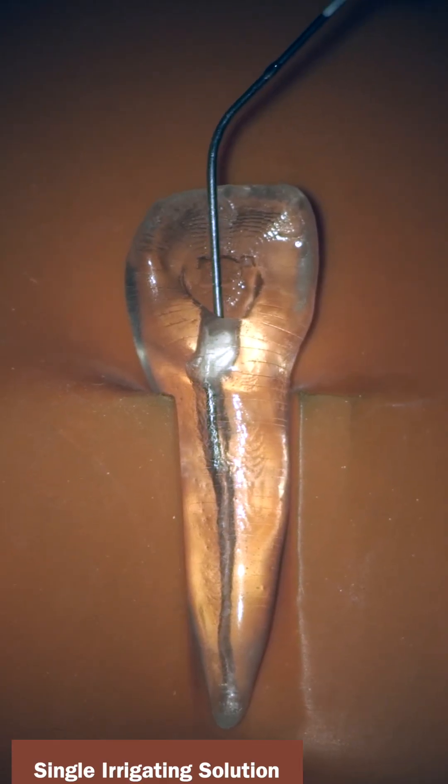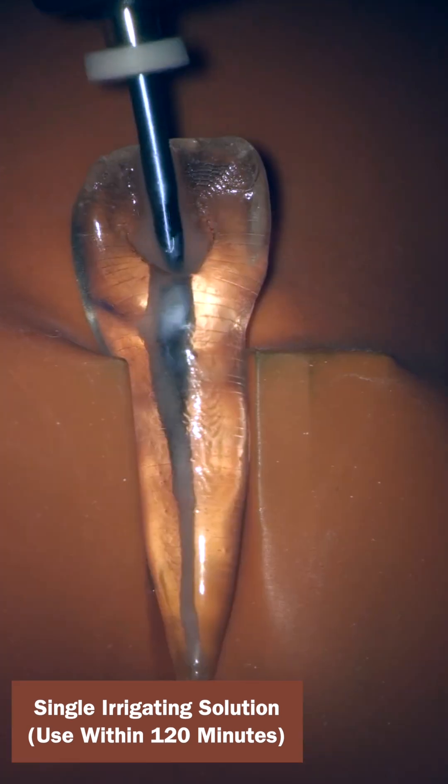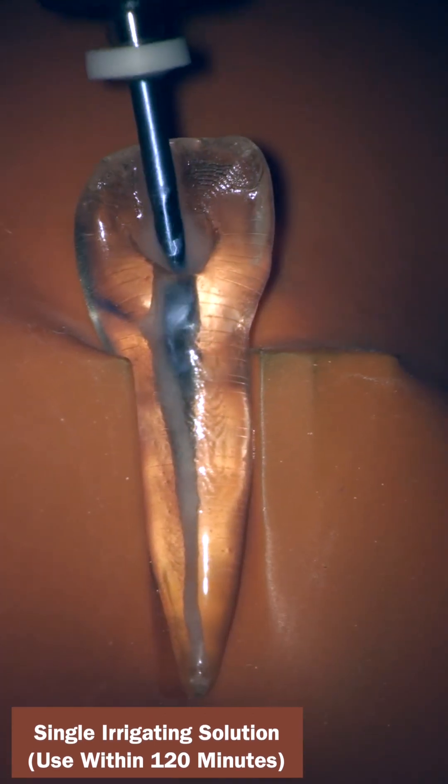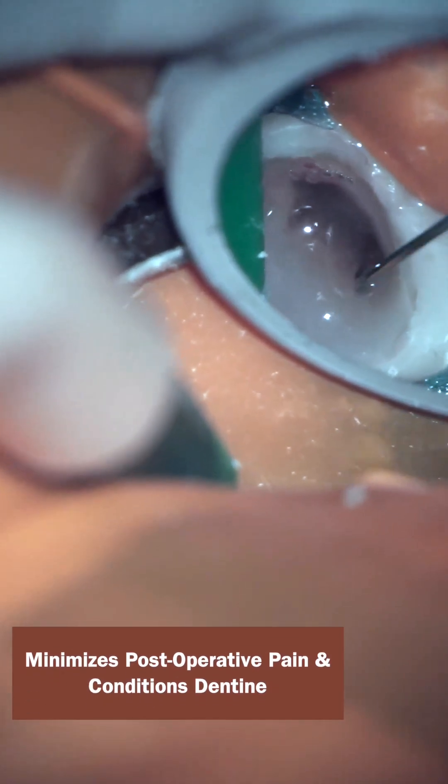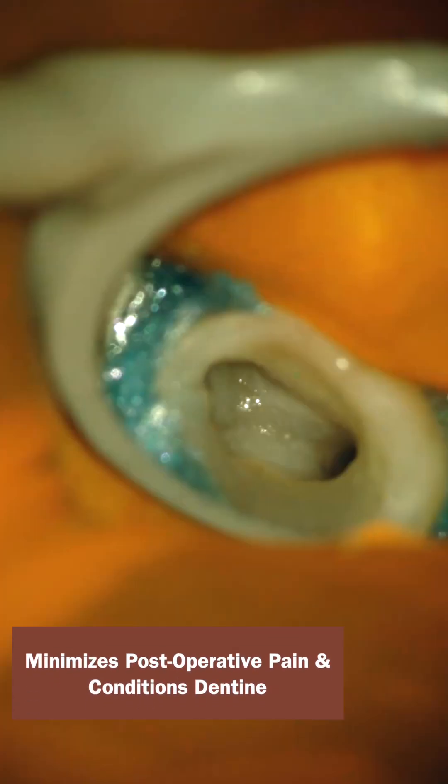A single irrigating solution for rotary instrumentation and as a final rinse, ready for use in seconds. TwinClean reduces post-operative pain and conditions dentin to receive the sealer effectively.